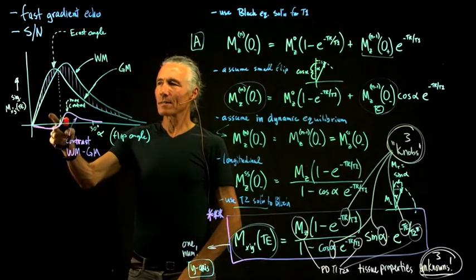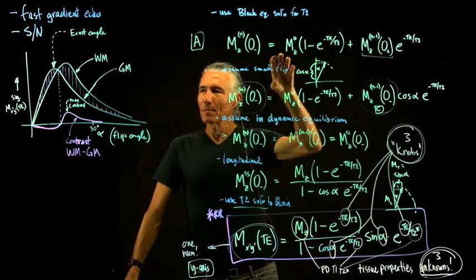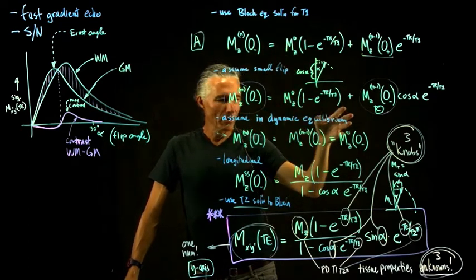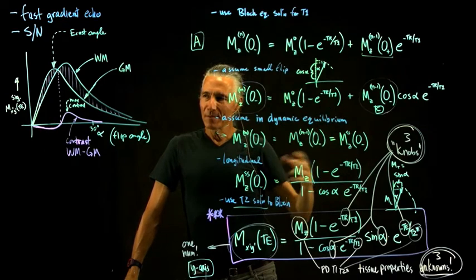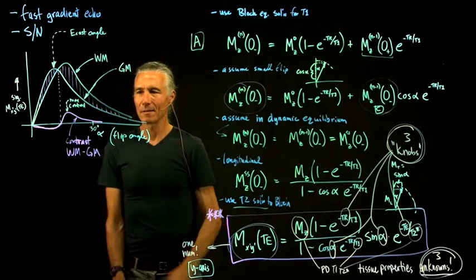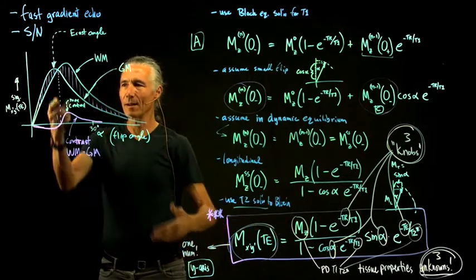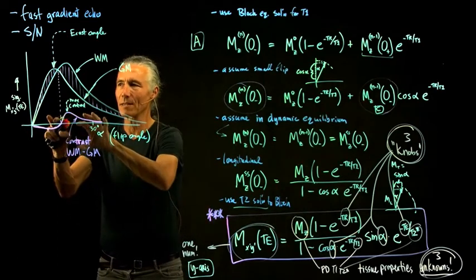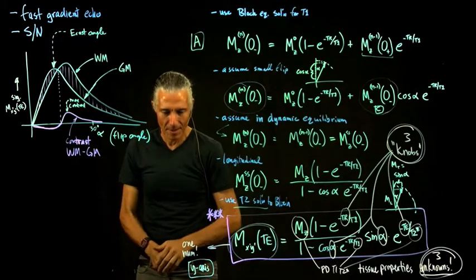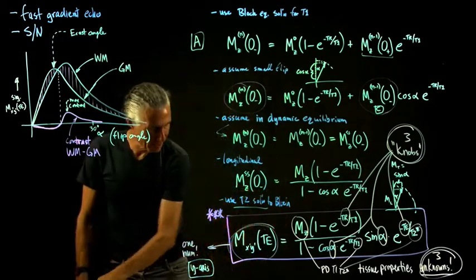So this is what's happening, and we got that from starting with very simple assumptions about the Bloch equation, assuming that we were in this equilibrium, putting in the T2 star decay, getting this whole mess, and then you can plot it. And that's part of the assignment: take this equation and plot it out for different tissue types and just do what I just did right here in MATLAB. Okay, so that was useful. That's an actual real pulse sequence.